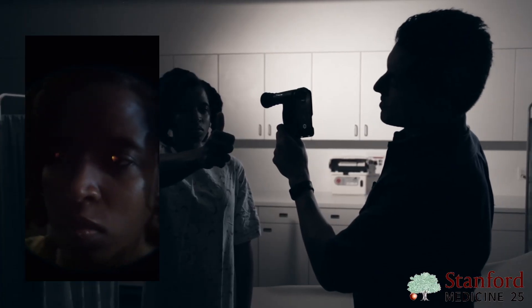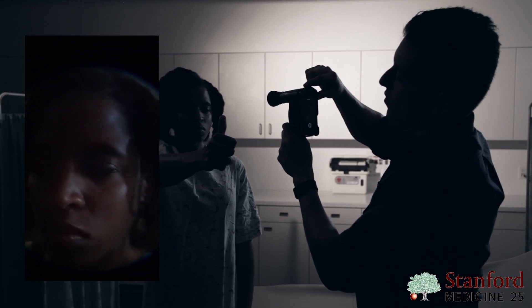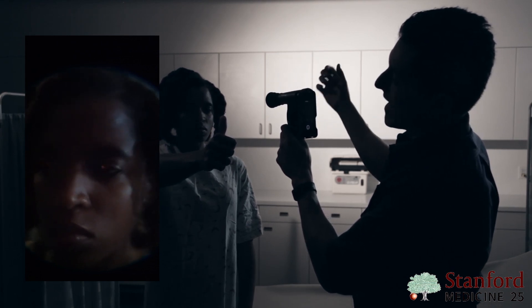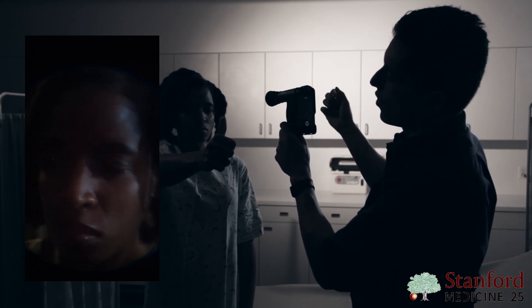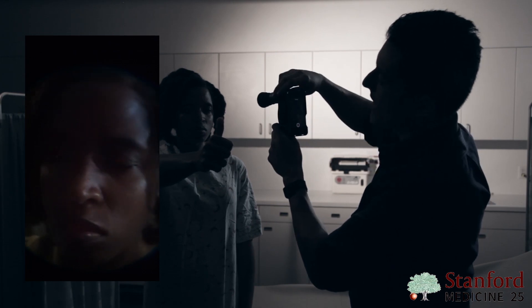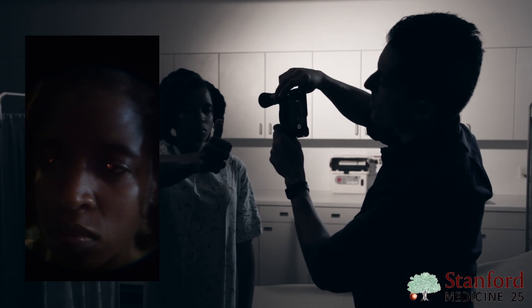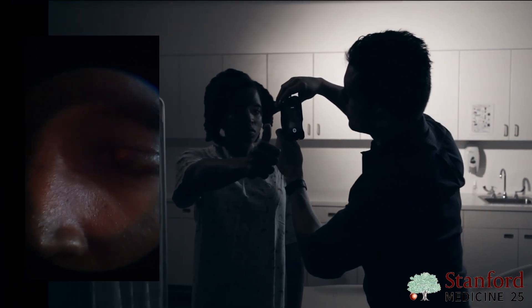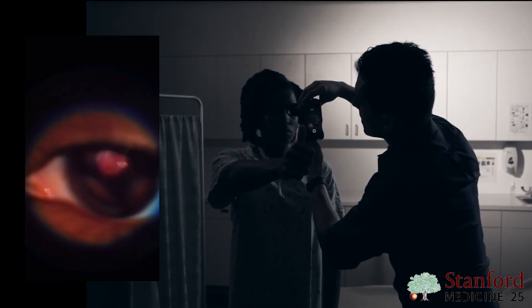The red reflex is important for two reasons. First, it tells you that the path from the scope all the way to the back of the retina is intact — nothing is obscuring it, such as a retinoblastoma in a young patient or a cataract blurring the lens. Second, it tells you that your angle is perfect for actually visualizing the retina. The last thing to do is simply go in and follow that red reflex. If you lose it, no problem — just come back, find the red reflex, and go back in again.